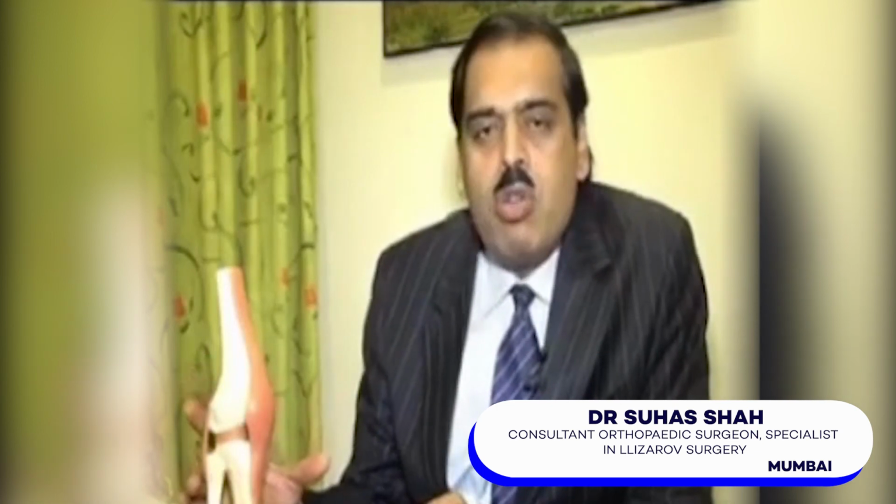This surgery is done with a minimal incision, and the incision is taken below the tibial tuberosity for correction of the deformity. The fixator is applied to the leg, and this fixator stays for 2.5 months. During this period, the patient corrects the deformity with the fixator, and once the deformity is completely corrected, the patient gets complete relief from the osteoarthritis of the knee joint.